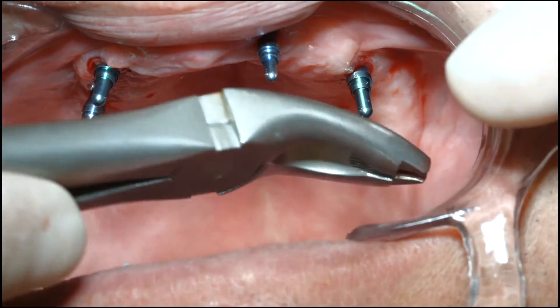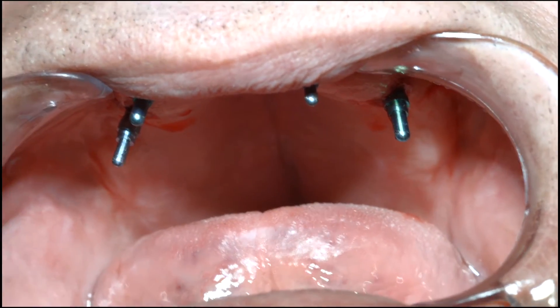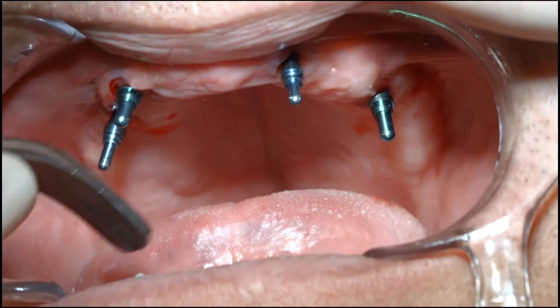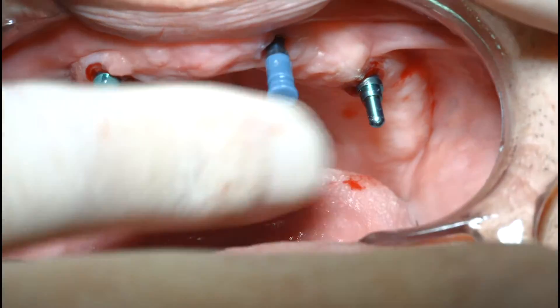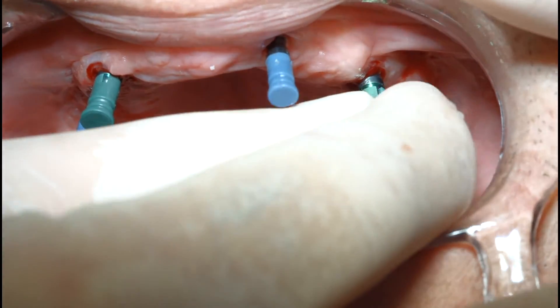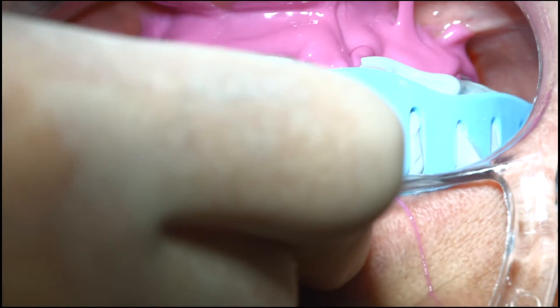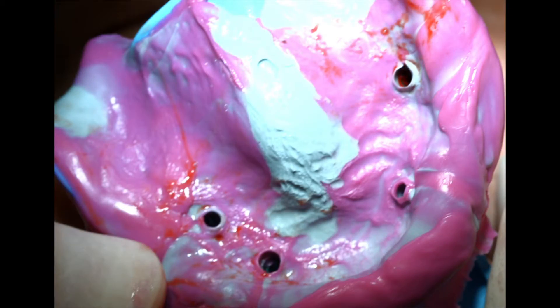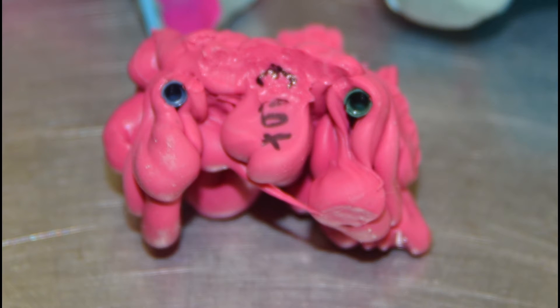A maxillary and mandibular full-arch implant-level transfer impression was made by inserting eight color-coded metal impression posts with only finger pressure into their corresponding implant wells. Color-coded acrylic sleeves were then inserted onto the metal posts prior to making a full-arch impression. After removal of the impression tray, a bite registration material was injected around and between the eight impression posts to record a preliminary positional relationship between the patient's two dental arches.